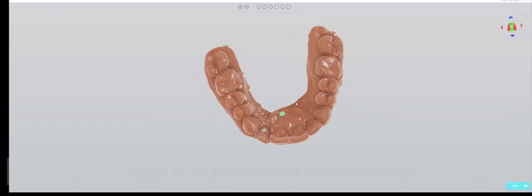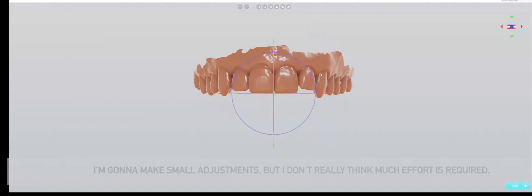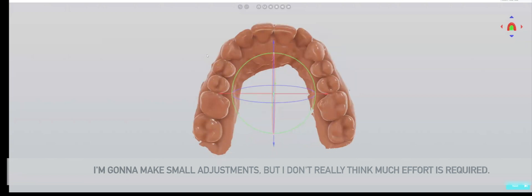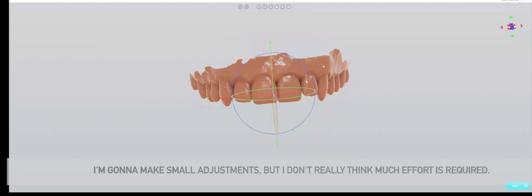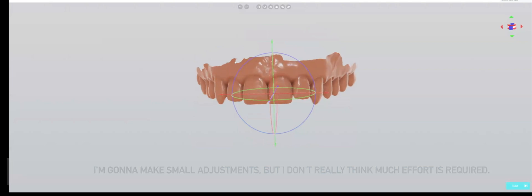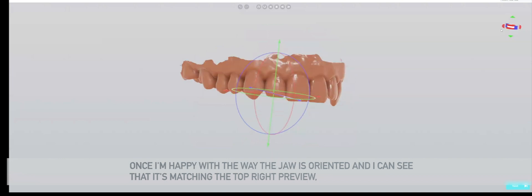We see that the imported jaw doesn't match. To match, we just need to click three times in these locations. The system will automatically align the jaw. I'm going to make small adjustments, but I don't think much effort here is required. This looks good to me.